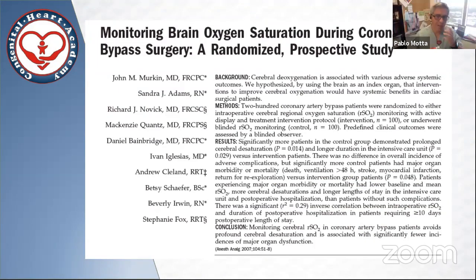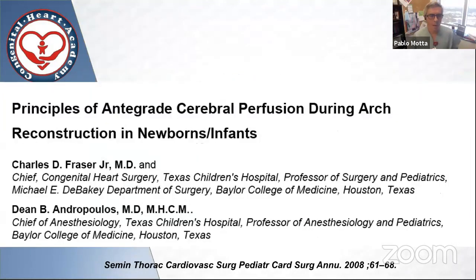The group from Merkin eventually tested their algorithm. They described it in a paper, and then they tested, and they showed that monitoring cerebral regional saturation in bypass patients avoids desaturation. The question is, will avoiding desaturation improve the neurological outcomes? That is what we are interested in.